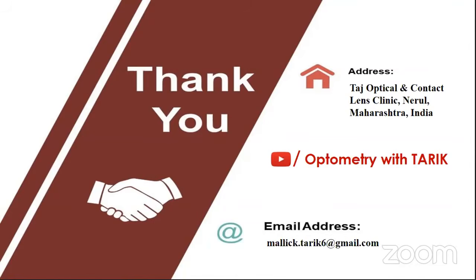And in the indirect method, I can assess it with the help of your NRA and PRA, as already discussed, because the moment I put plus lenses in front of your eye, that will reduce your accommodative convergence, and you need to use your fusional convergence to cope with it, vice versa with your PRA. And indirectly with the help of your MEM also you can find it out.